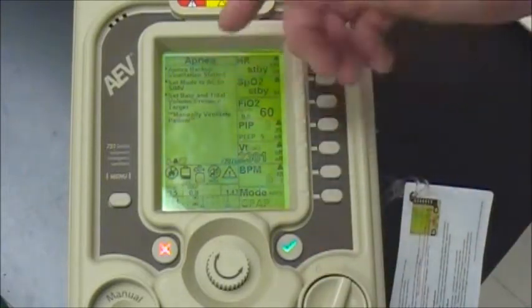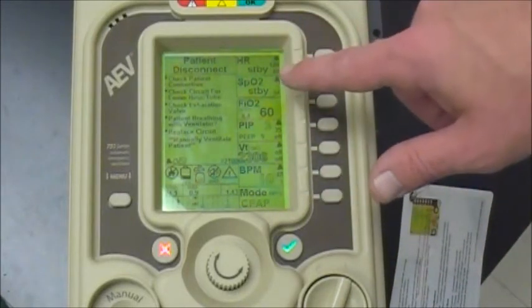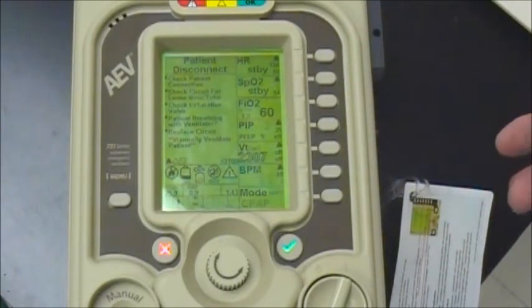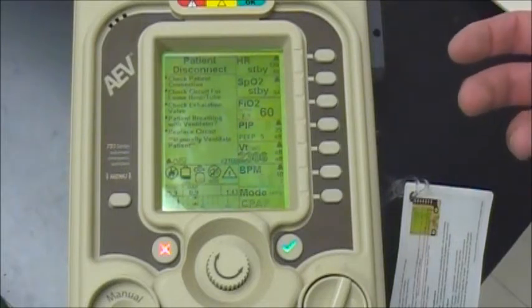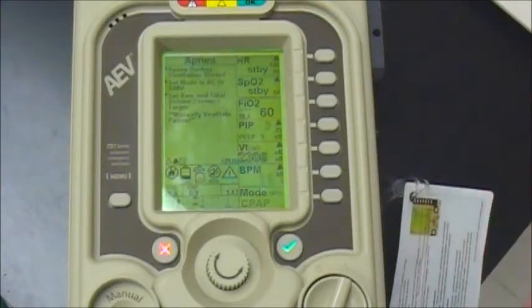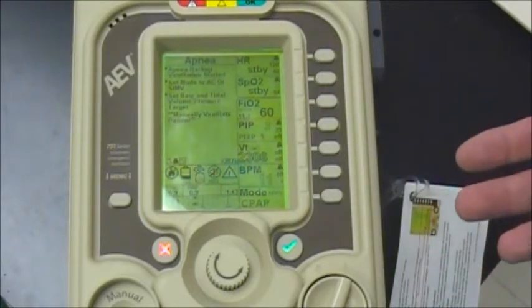The apnea alarm tells you that your patient's not breathing at least 12 times a minute. If that triggers, you're probably going to have to be more aggressive and start ventilations with a BVM and proceed to intubation — or it could be as simple as just encouraging them to keep breathing on their own. Remember that you can only apply BiPAP to a patient that's conscious, alert, able to follow commands, and able to trigger their own breath.